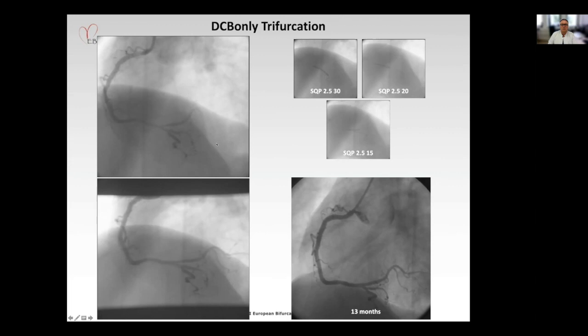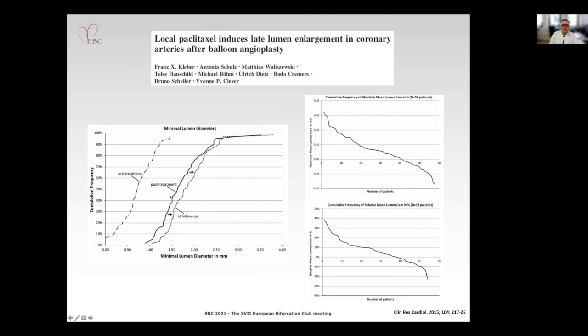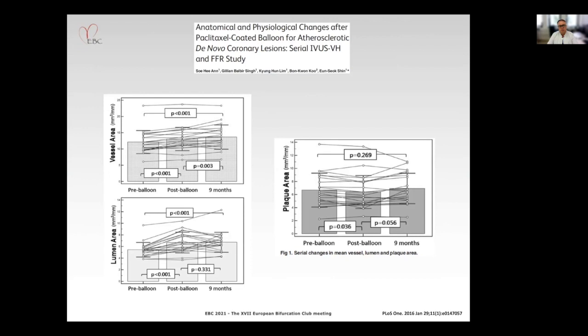Here you can see a clinical example — one of our early trifurcation cases. We used three DCBs in all three branches of this right coronary artery. This was the initial result, and after 13 months, you see an increase in lumen in all side branches, which is very common after DCB only treatment. We call this effect late lumen enlargement. And here you can see the MLD distribution of a series of patients at four-month follow-up — there is a shift from left to right in MLD distribution, which is unique for this DCB only treatment.